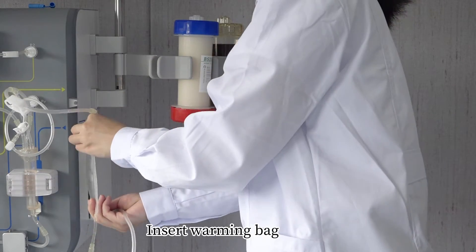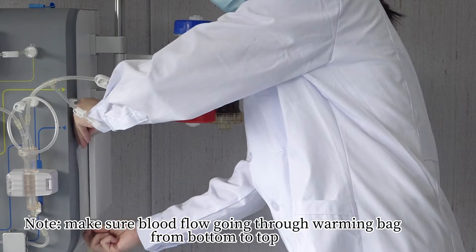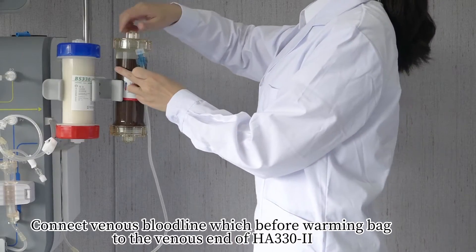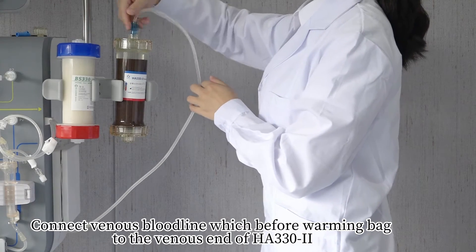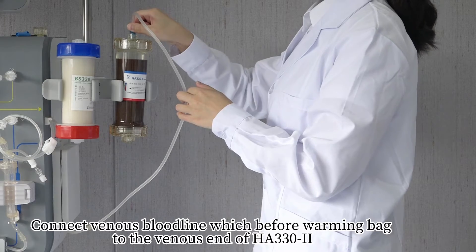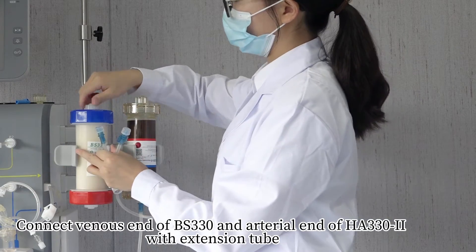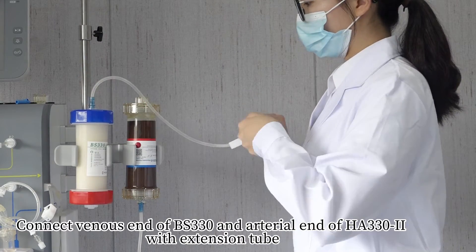Insert the warming bag. Note: Make sure blood flow goes through the warming bag from bottom to top. Connect the venous bloodline before the warming bag to the venous end of HA-330-2. Connect the venous end of BS-330 and the arterial end of HA-330-2 with an extension tube.